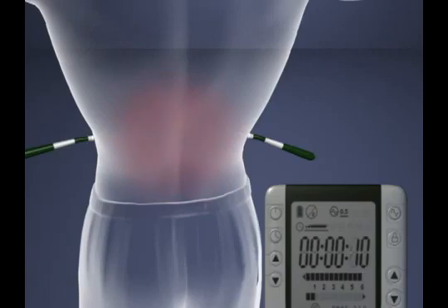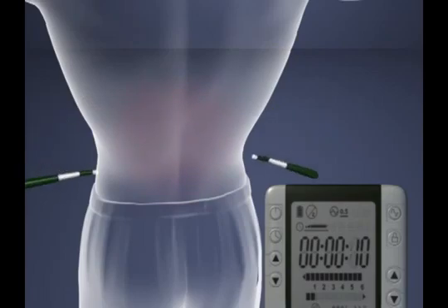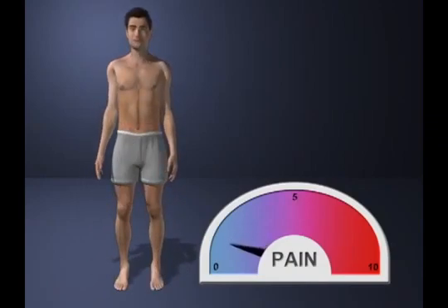For back pain, place probes in at least 3 places on both sides of the body at the level being treated and slightly above and below to direct the current through the nerves and spinal cord. Repeat as necessary, varying the probe positions. Continue treatment until pain is completely gone or maximum relief is achieved.